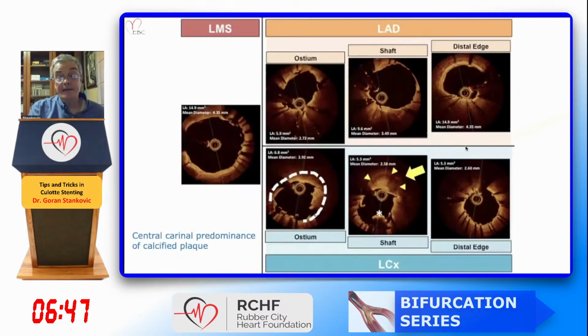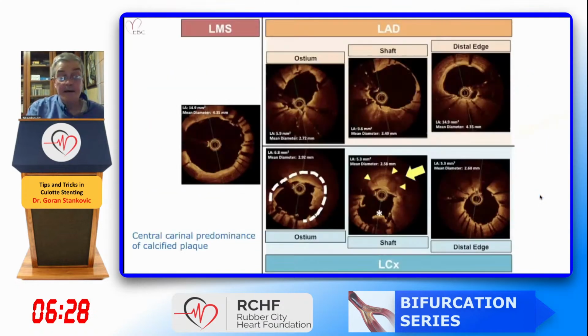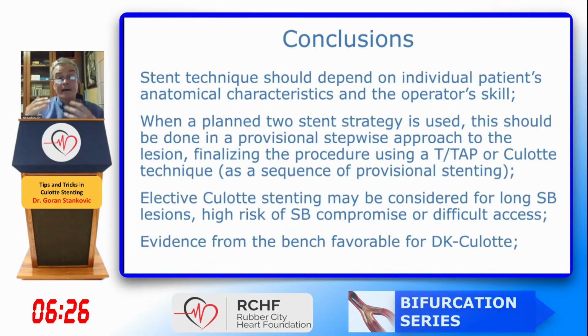So this is the OCT, and this is the point of a nodule that was actually calcified nodule with central carinal predominance that was the cause for such complexity of this intervention. So it's never the end until you really perform imaging and confirm good expansion and optimal result.